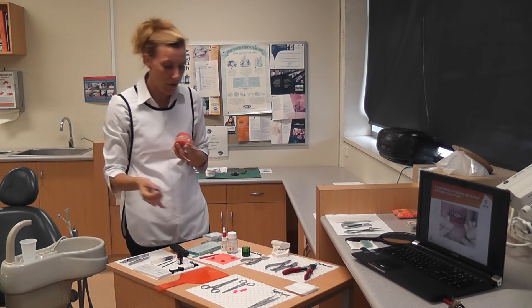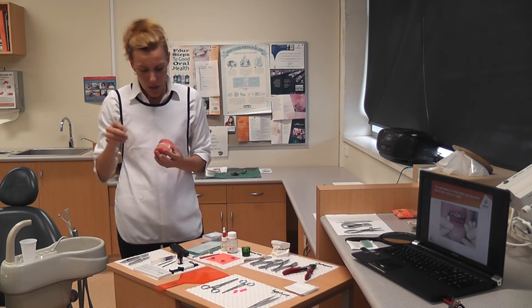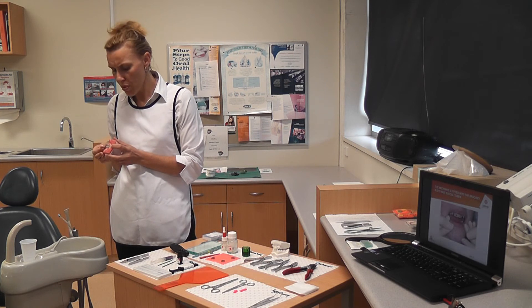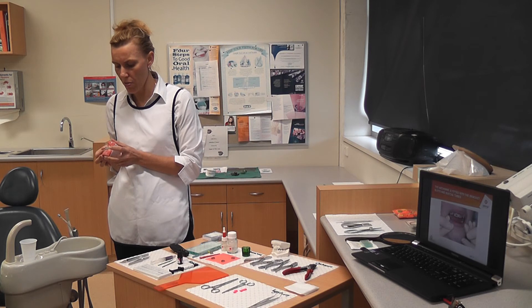You need to be familiar with all of these instruments. That's how we thread the wire in. Once it's in position, we often have a bit of excess arch wire sticking out the back. What's the problem with that jamming out the back there, if you were the patient?